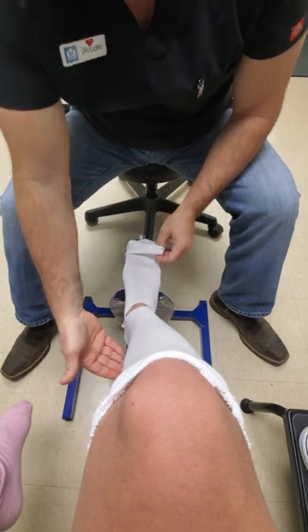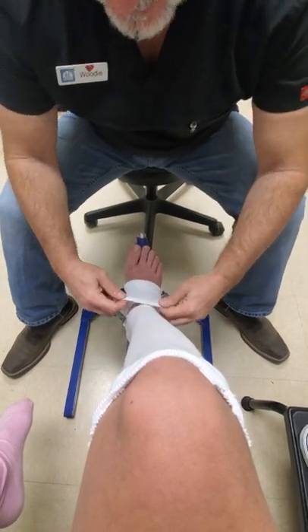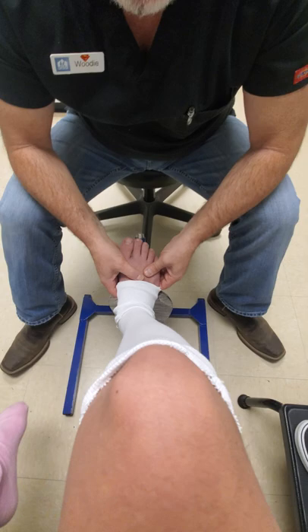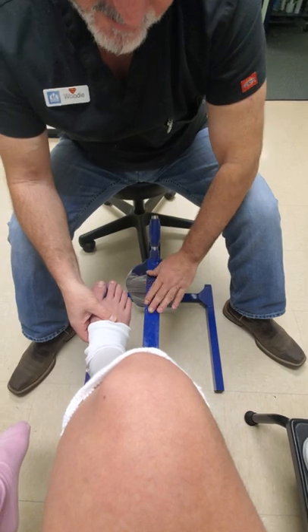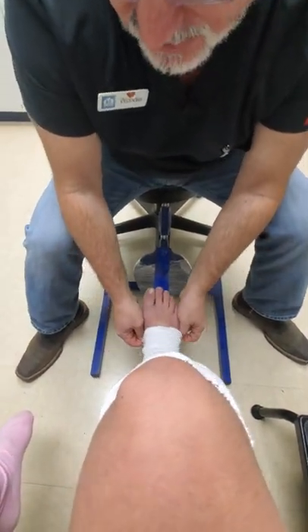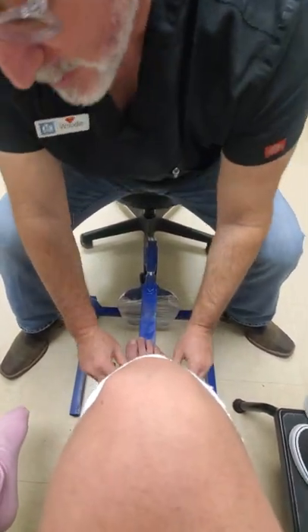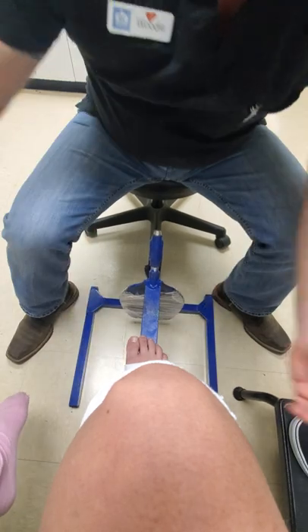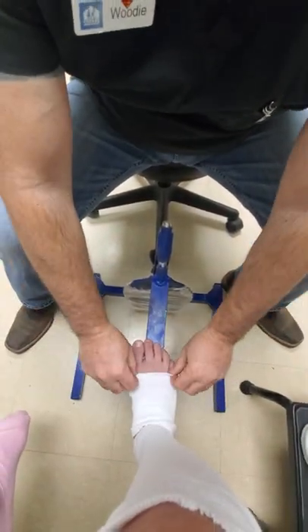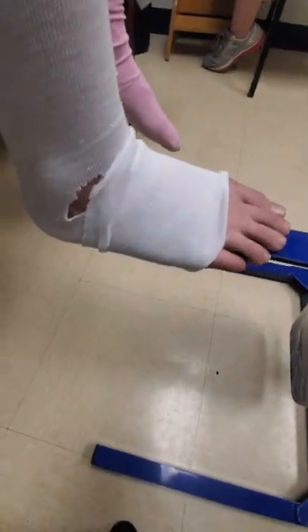For this demo, since we're using the cast stand below, I'm going to fold back the sock on this teenage leg. I'm going to have the patient lift their foot up, and we're going to slide this portion of the cast stand between the stockinette and the foot — nice and easy, working with the patient. Granted, you're working with a patient who typically has an injury, so you want to work with them to create a nice right angle as much as they can tolerate, following the doctor's orders.